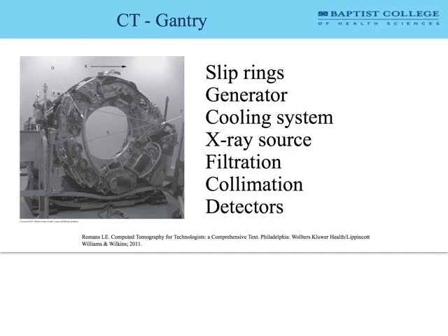Then it will have some kind of cooling system, and it's typically fans. And that's what we have on this CT scanner here. You can see there's a bank of fans. I'll try to indicate them right in here. And they're around the detectors, but we'll have other fans in other places doing a lot of cooling. And you'll hear those fans the minute you step into a CT room, just trying to cool off all the electronics, as well as the generators and the x-ray tubes and things like that.